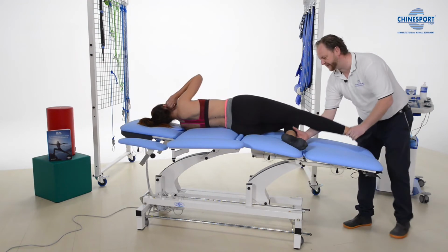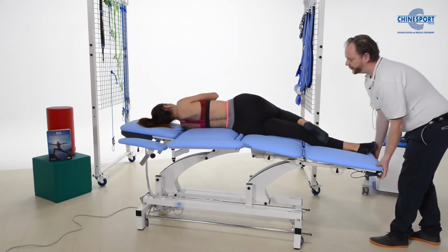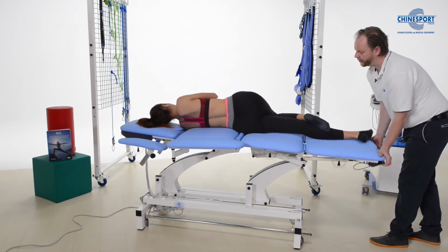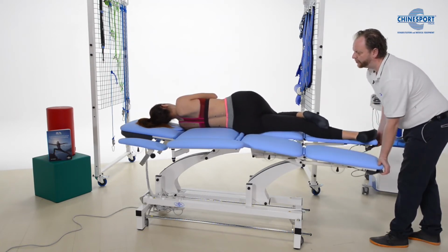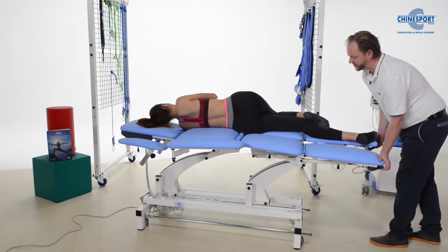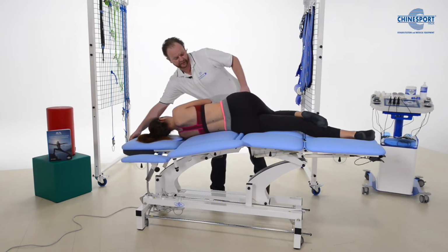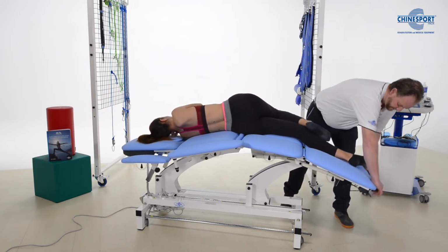If we switch our legs, bottom one straight, we can see also by moving here, we can do a small test and see how her spine, if we keep the leg here, wobbles or how the spine moves, and see if there's any segments that may be locked or blocked. And if that's the case, we may want to go into mobilizations.